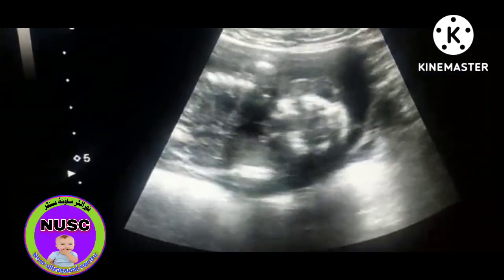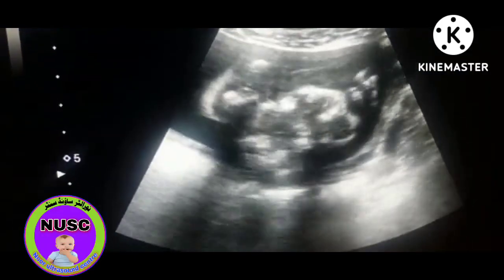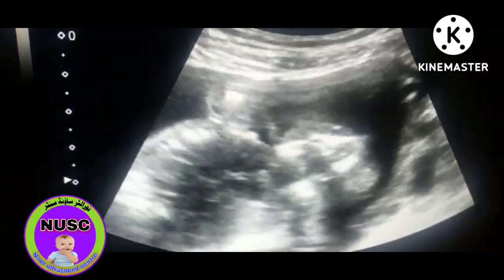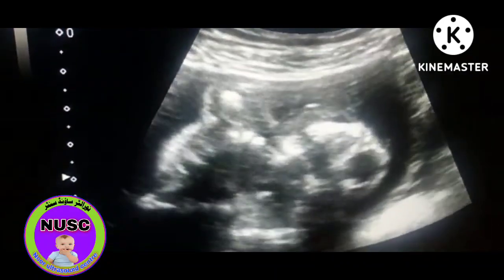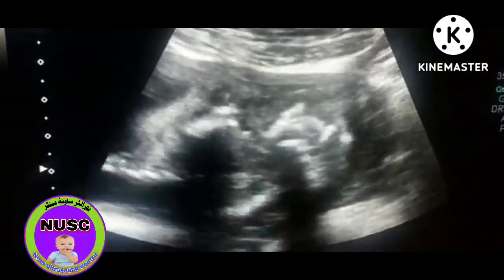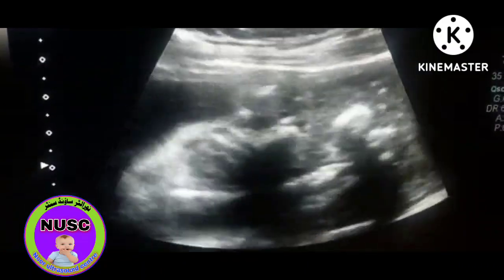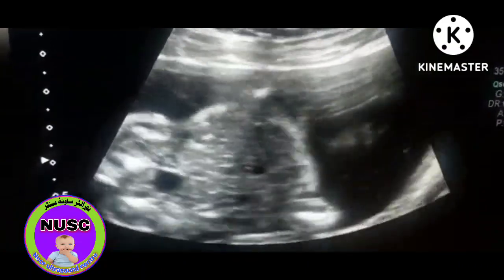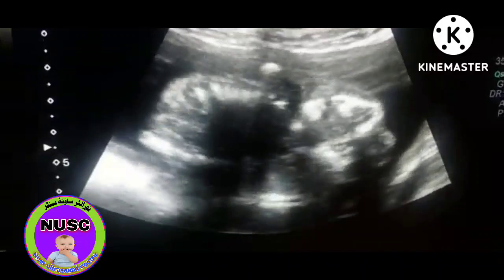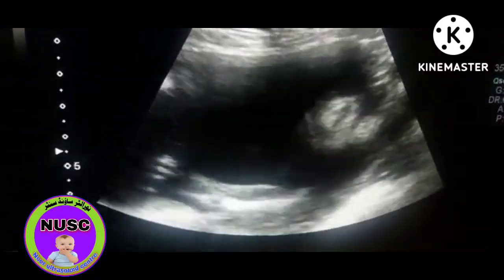Bismillahirrahmanirrahim, Asalaamu Alaikum everybody watching me. I am Dr. Sheikh Resheed from Pakistan, working as a sonologist. Here you see we are performing an obstetrical scan. This is an anencephalic fetus.